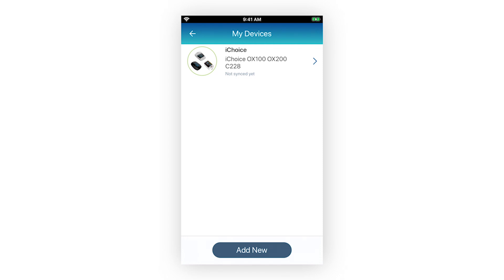Allow a few moments for the measurement reading to sync with your account. When the measurement reading successfully syncs in your account, you can start capturing more measurement readings with this Bluetooth medical device.